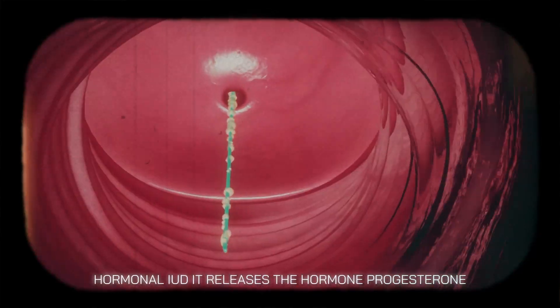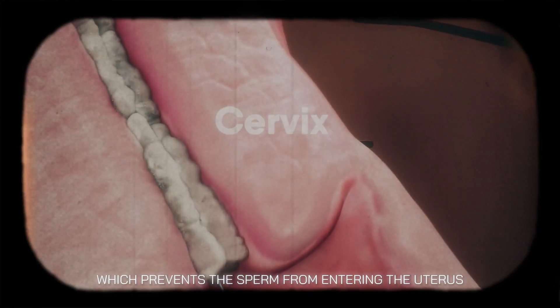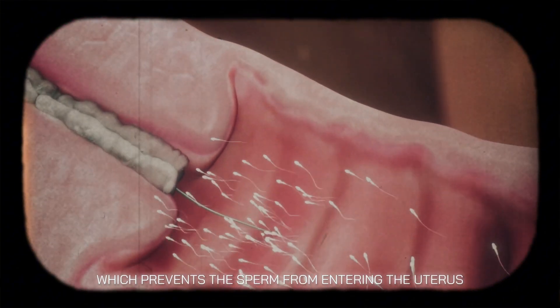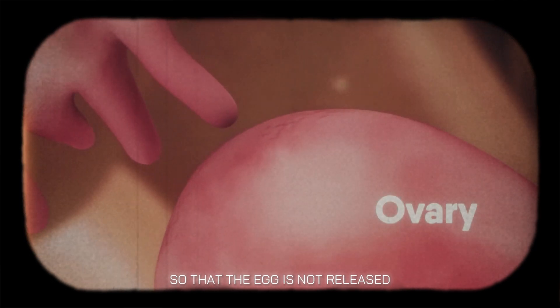The hormonal IUD releases the hormone progesterone, which thickens the mucus of the cervix, preventing the sperm from entering the uterus. The hormonal IUD also suppresses ovulation, so that the egg is not released.